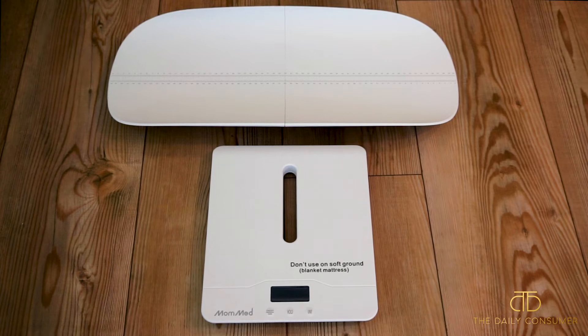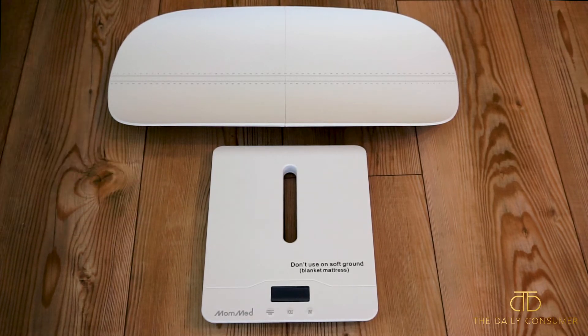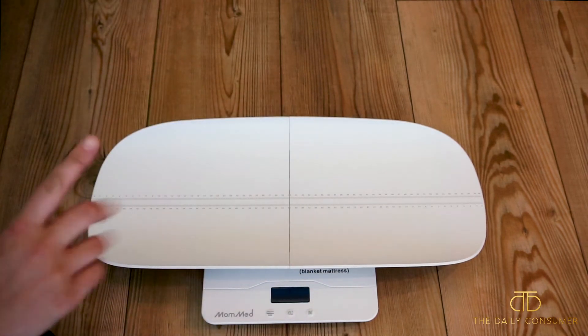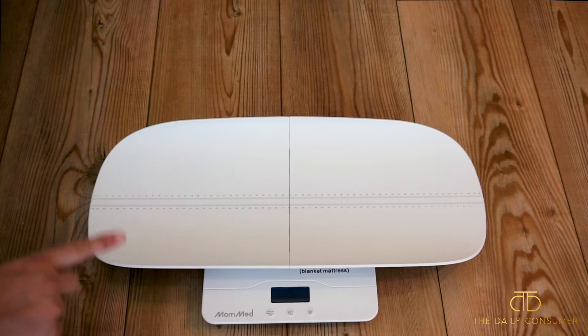I have it separate right here, but you can see this bottom portion has a nice spot in the middle that you're just going to connect the actual baby portion to, to make it accessible for your baby. I'm going to go ahead and connect that now. Those two pieces just pop together really easily, and then you'll just connect it to the bottom portion.